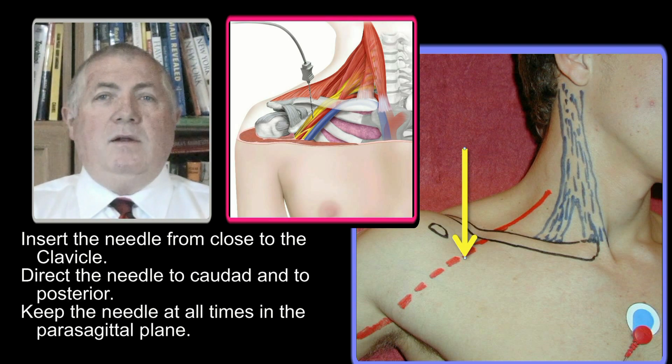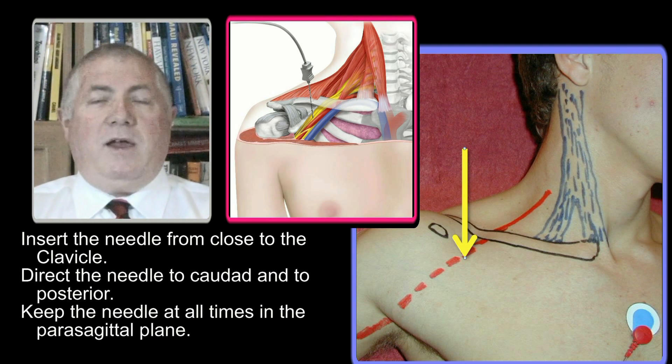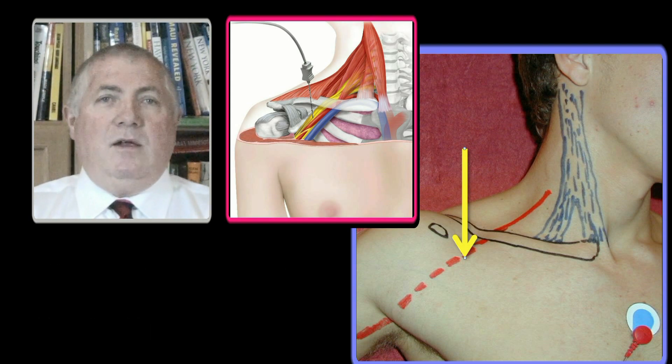The nerve block needle must be inserted from the clavicle towards caudal in a parasagittal plane. To stay within the parasagittal plane, one should avoid directing the needle too medial, to avoid causing a pneumothorax. Also, do not direct the needle too lateral. More lateral injection points result in less complete nerve blocks.